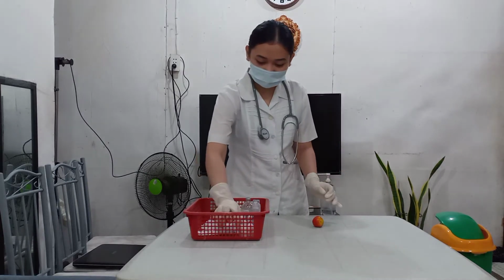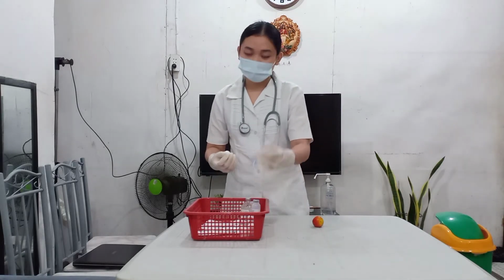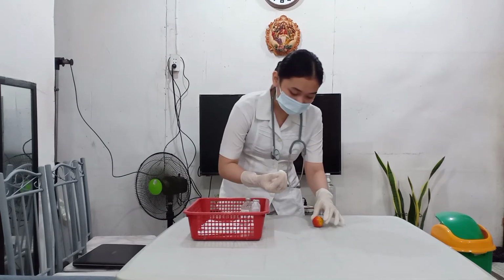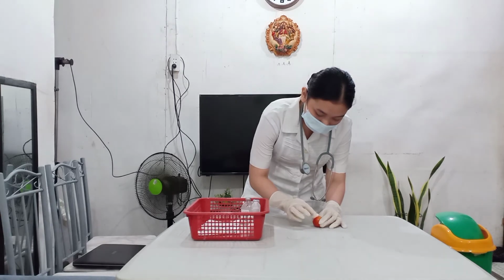So, in this step, I will be using a cotton swab and the alcohol, and then we will do a circular motion starting from the inside to the outside.